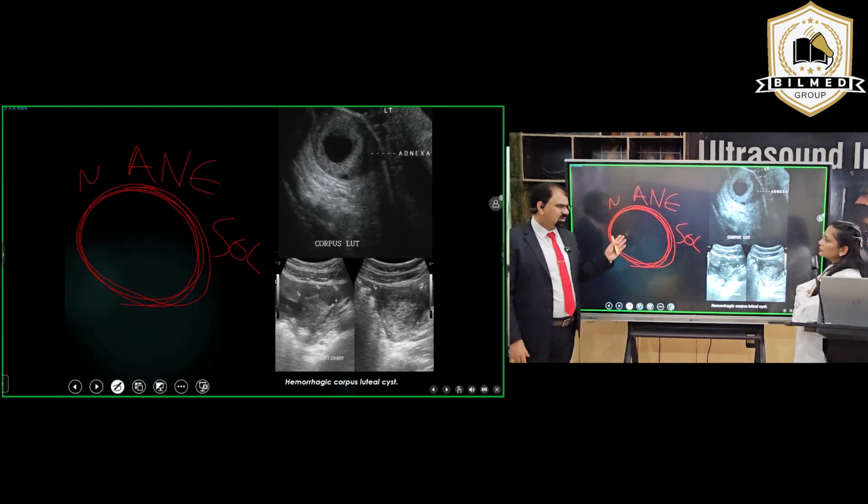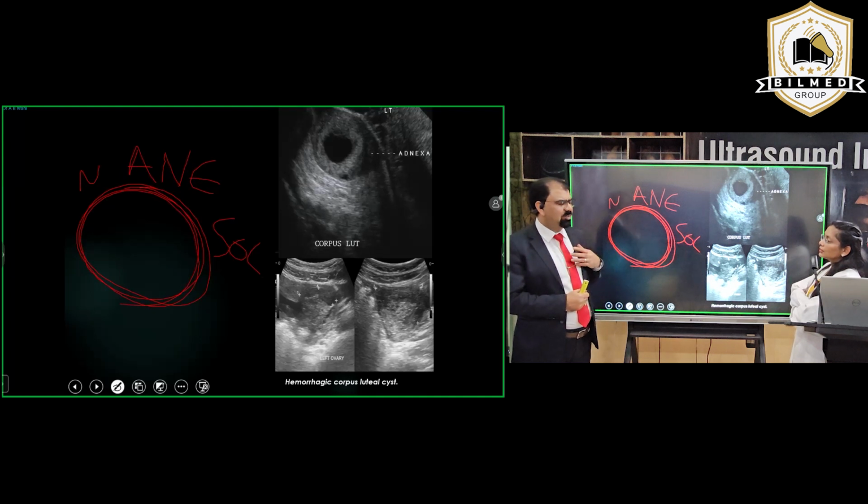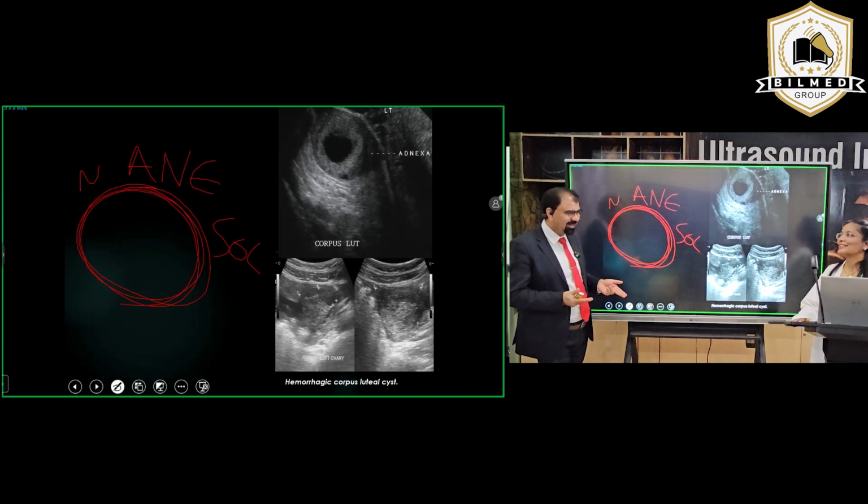Okay. How can you differentiate it? Actually, color Doppler is the basic thing? No. I will not say color Doppler is the basic thing. If I am a poor doctor, I don't have a color Doppler. Will I not be able to diagnose, differentiate rather, this from that? In a dermoid cyst, there will be more echogenic structures seen. Think more. This corpus luteal cyst. History? Yes, history. But before history, what days you are in? Okay, yes. The basic thing, what days you are in.